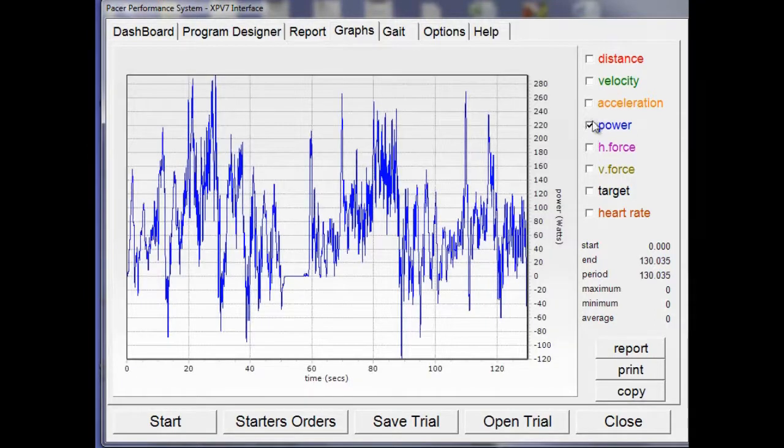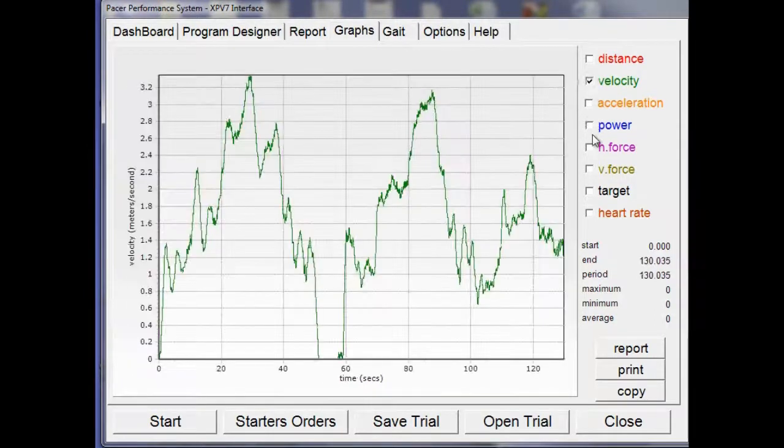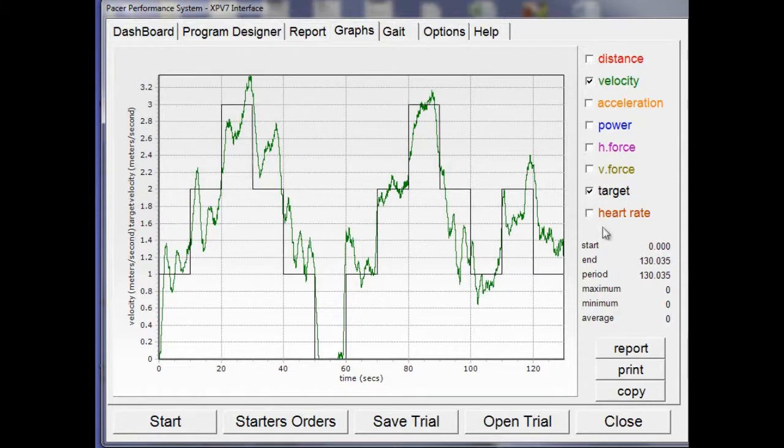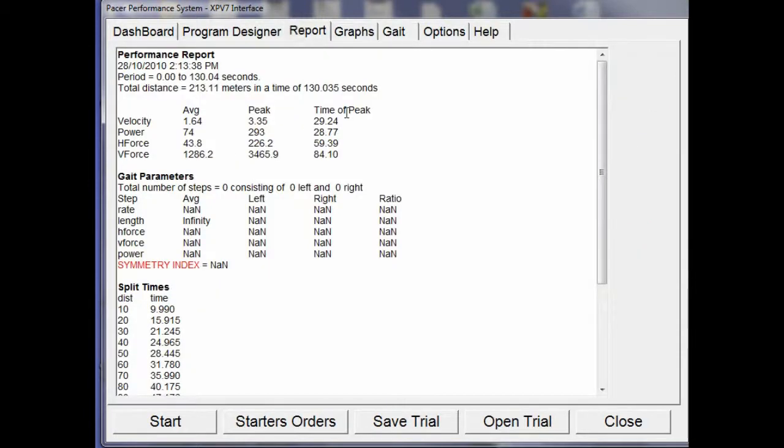And then you can select the portion of the graph to create a report. So we are just going to report for the whole session. Here you can see the report in the first section. This is taken from the graphs tab. It gives you velocity, power, horizontal force, and vertical force in average, peak, and the times of those peaks.